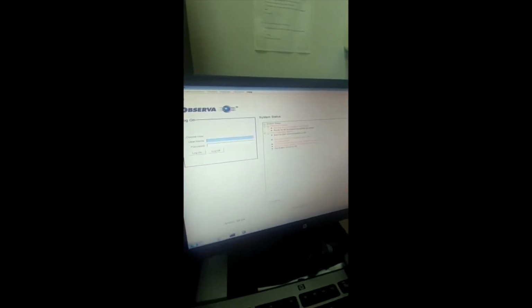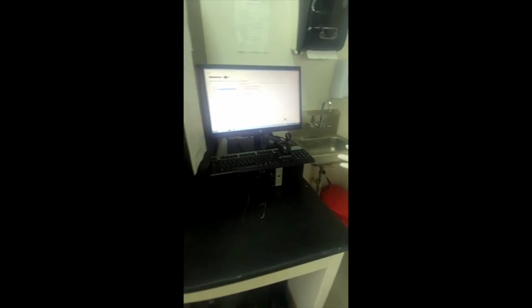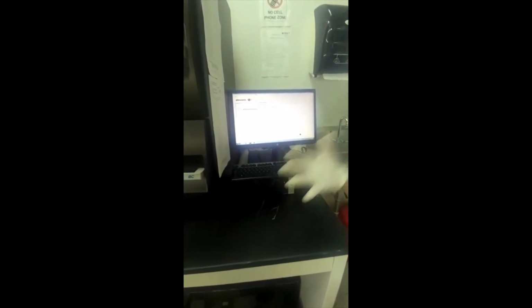So when you scan the bottle, does the patient information go on, or do I have to type it all in? Well, it depends. There are some systems that allow the information to be entered at the time of the request, and then the sample comes with the barcode. So when we scan it, everything goes on. Where we are now, we are the ones that enter it. The system also allows for flexibility, so we can enter it, or if there was something inaccurate, we can go on and change it and so on.